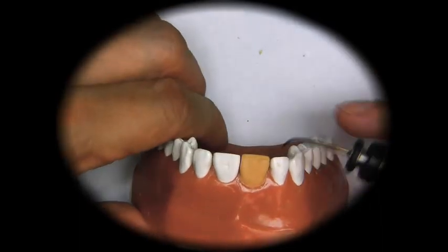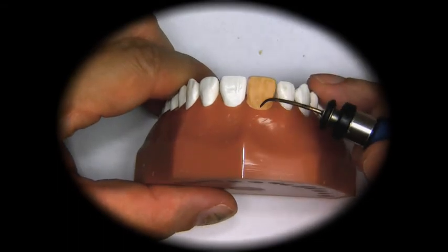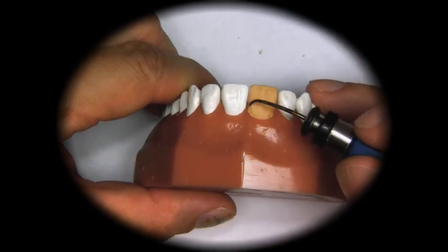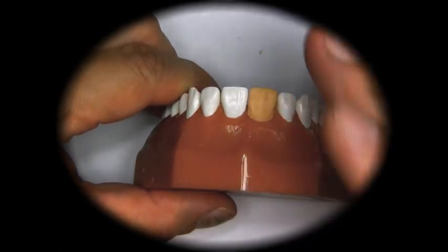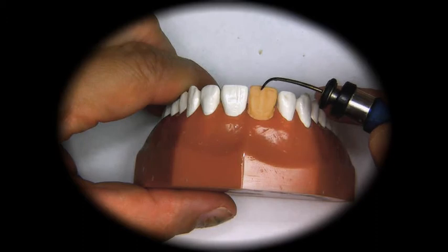So if we look at it, obviously this tooth is going this way. So we're going to have to take away from here a little bit to make it look like it's angled towards the median. The central lobe is also angled a little bit off, so we're gonna have to change the direction of that.